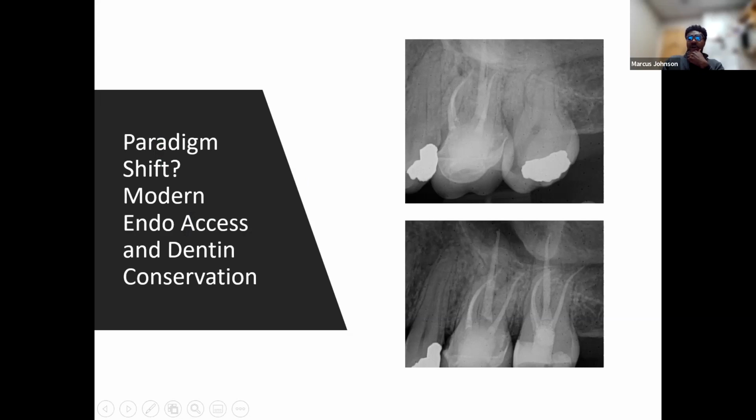Now keep in mind, contact is always important to protect the gingival tissues, but if the patient is going to be receiving a crown anyway, sometimes we can actually forfeit the contact, and we understand that based on the type of matrix you're using. Just for ease, I'll oftentimes reach for a Tofflemire. But the challenge that I find with the Tofflemire is you kind of get that kissing contact right at the occlusal surface.